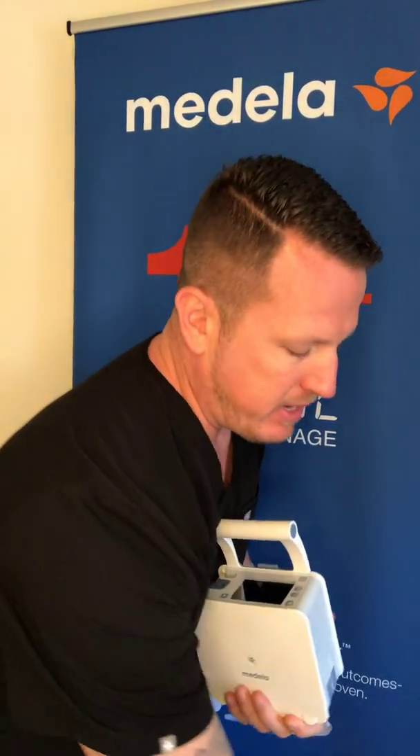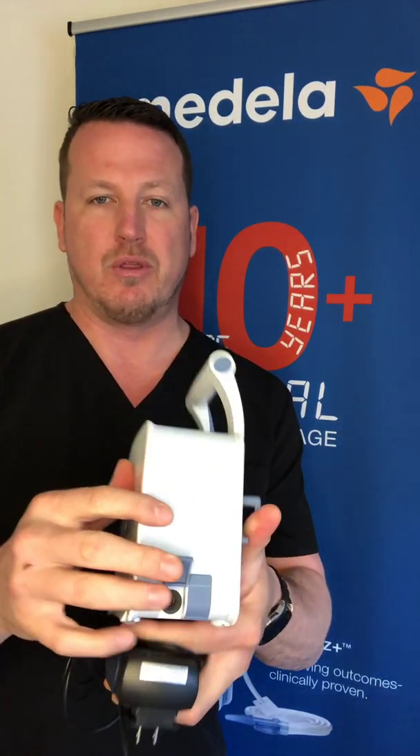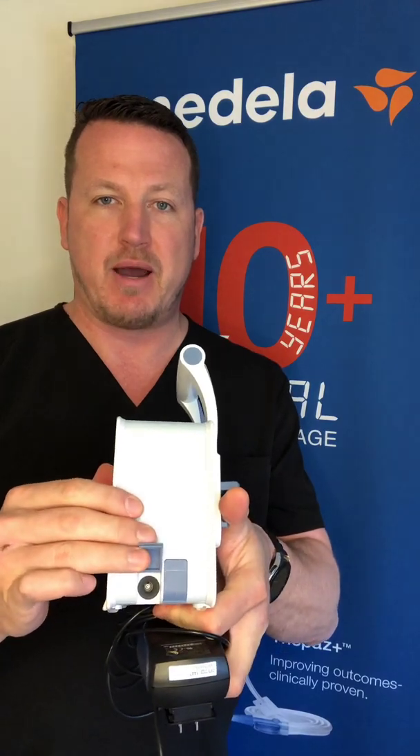When Topaz is in use it is recommended that the Topaz be plugged in using a power adapter while the patient is bedside. The power adapter is inserted into the port on the right side of the device, the mains power port.